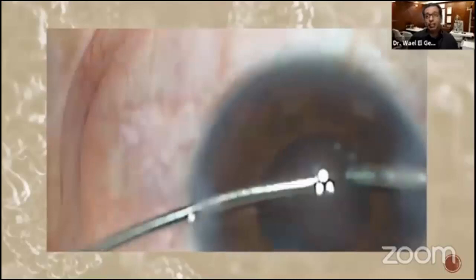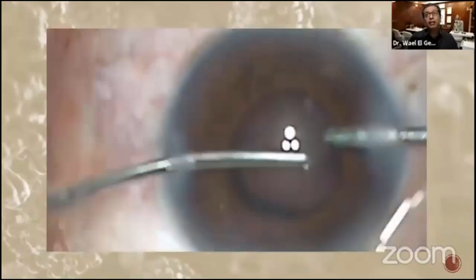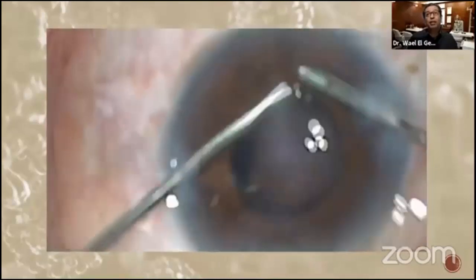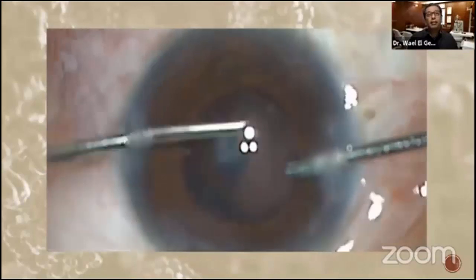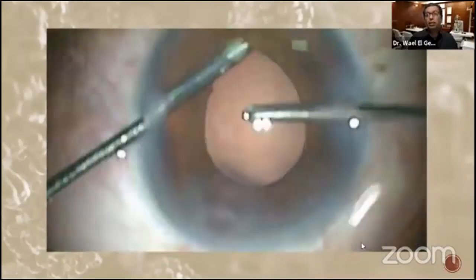Now the IA is very simple and very easy, no problem with it. And I have completed my surgery, very minimal power used, high vacuum used, high flow rate, polishing my anterior capsule. I can skip the IA part, and then I will do a simple implantation.